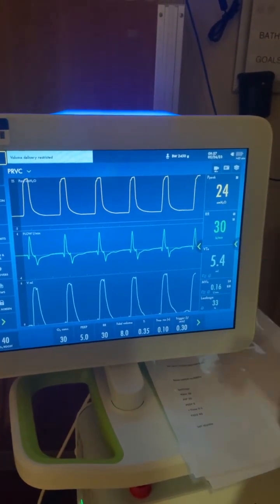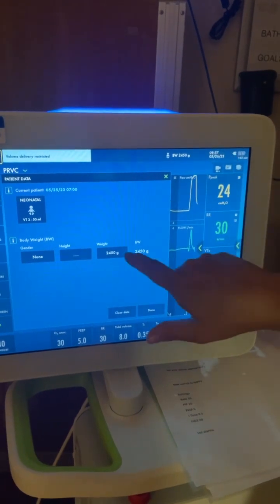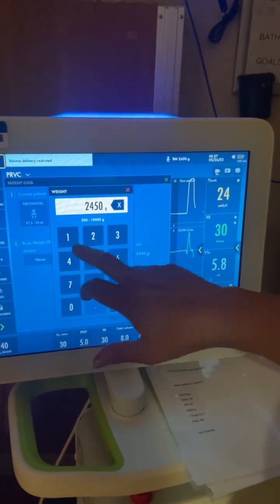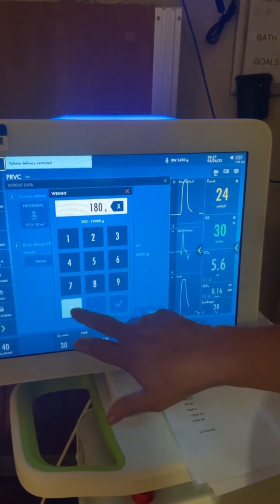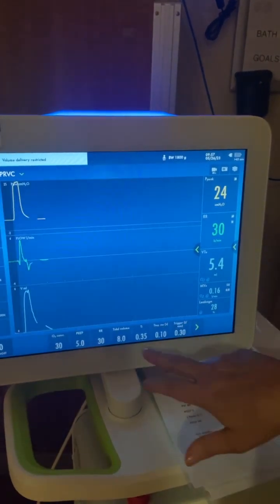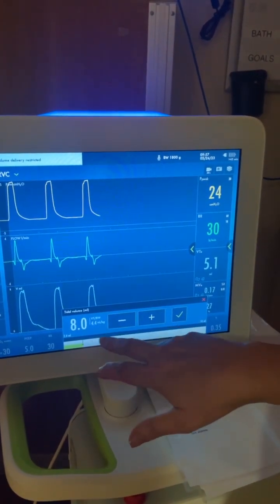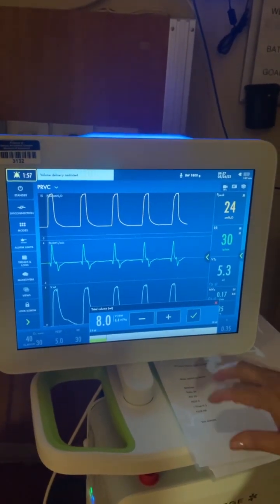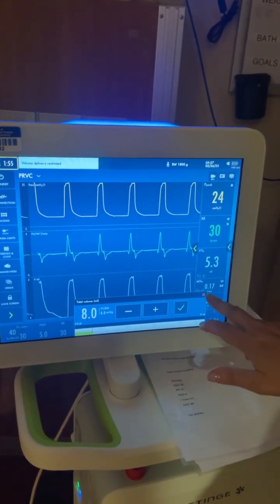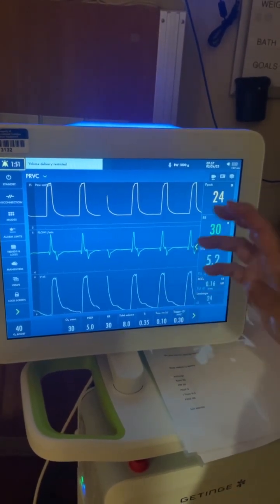And so that's some math you do, but you don't really need to do the math if you set your baby's weight up here. So if you set your baby's weight to 1,800 grams, done. And now I go back to that tidal volume, and that's 4.4 mLs per kilo. I'm going to silence that so we're not hearing that alarm.